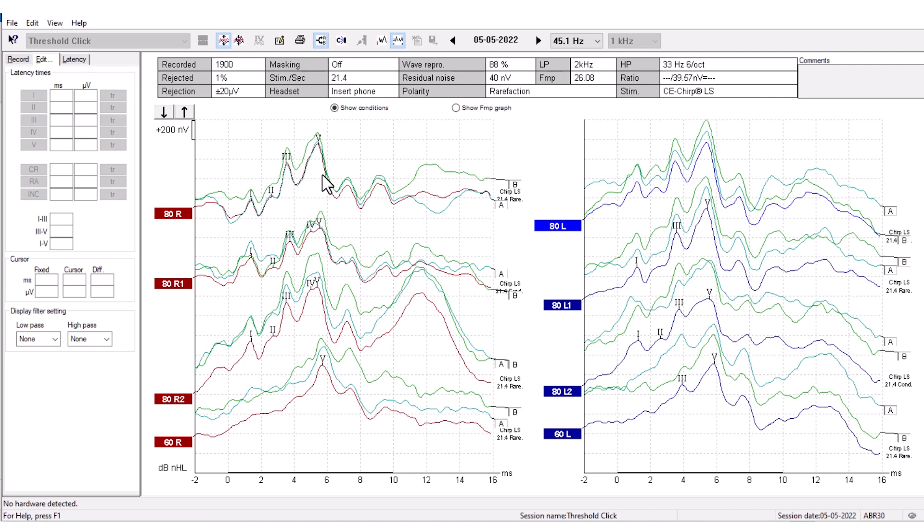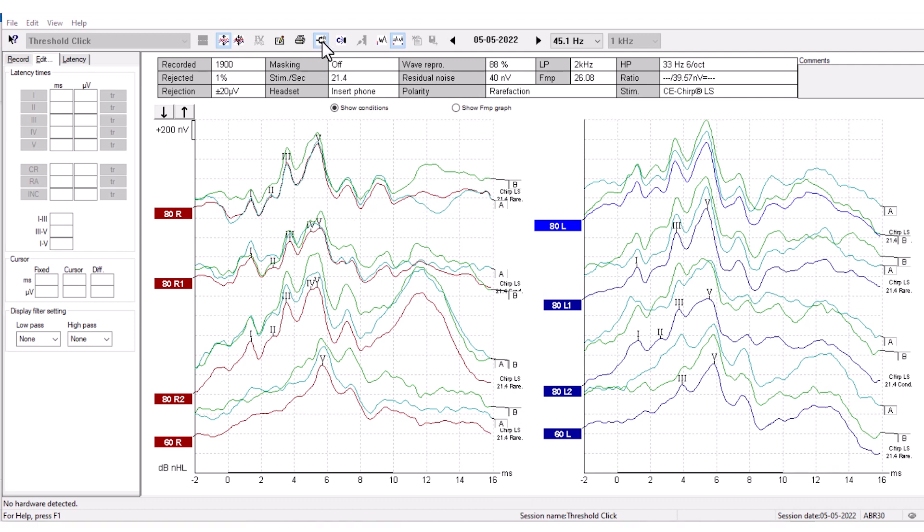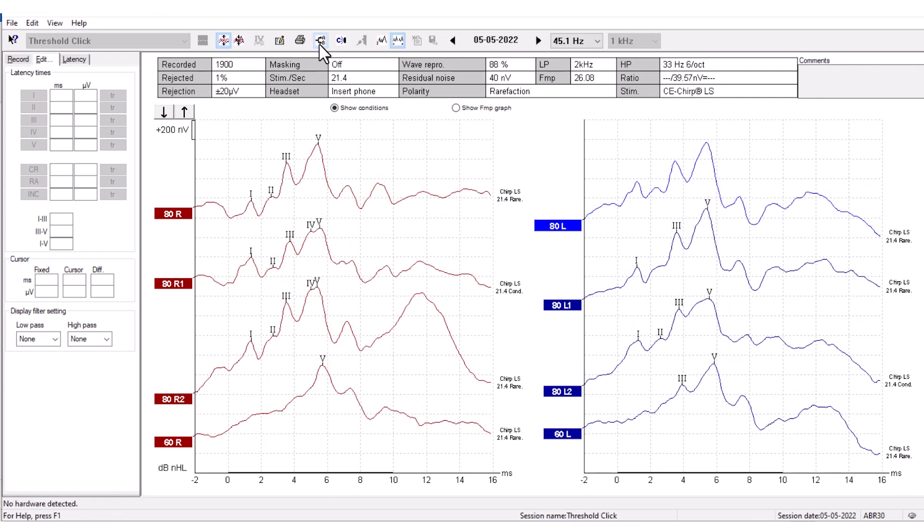You can use the A and B curves to evaluate wave reproducibility, as they are recorded as independent curves. With alternating polarity stimulation, the A curve will hold all the rarefaction sweeps and the B curve will hold all the condensation sweeps. Press the button again to hide all the A and B curves.